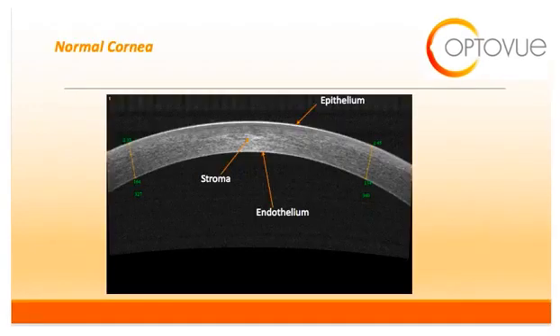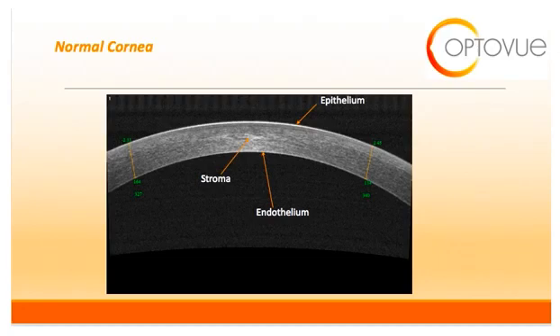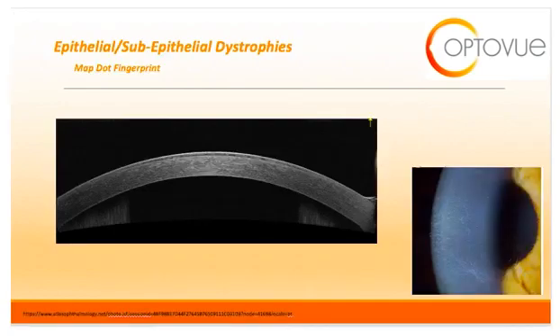This slide shows you what the normal cornea should look like on OCT. The most superficial surface is the epithelium, followed by the corneal stroma, with the most posterior feature being the corneal endothelium. The OCT can be extremely useful in identifying corneal dystrophies, as the OCT will delineate the layer of cornea involved.